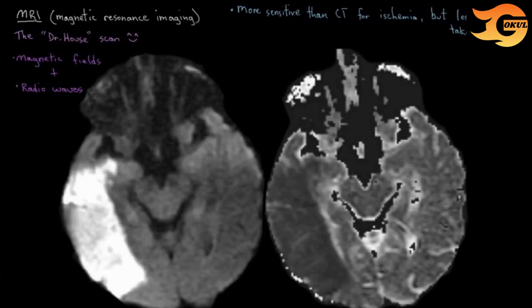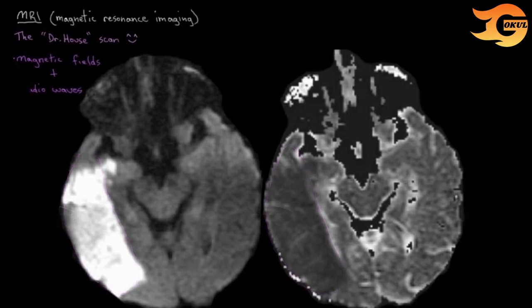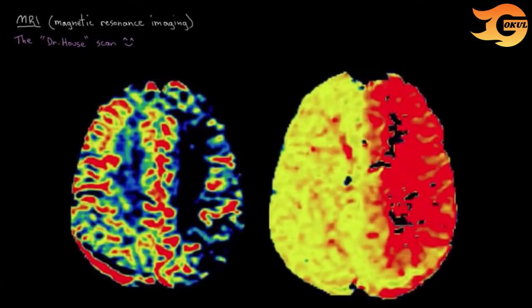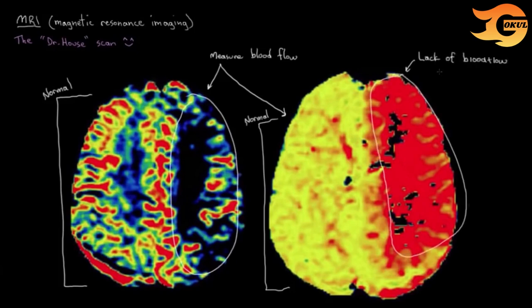Remember how it can take up to almost a day for brain changes to appear on a CT scan? That's not the case with MRI. These images were taken a mere half hour after the patient started having stroke symptoms — just incredible. You can see there's already ischemic brain changes happening in the right MCA territory. The next set of images measures blood flow through the brain: the right half is normal, but on the left there's a lack of blood flow, suggesting a clot in the left middle cerebral artery. These were taken only an hour after symptom onset, showing how quickly MRI can detect stroke.